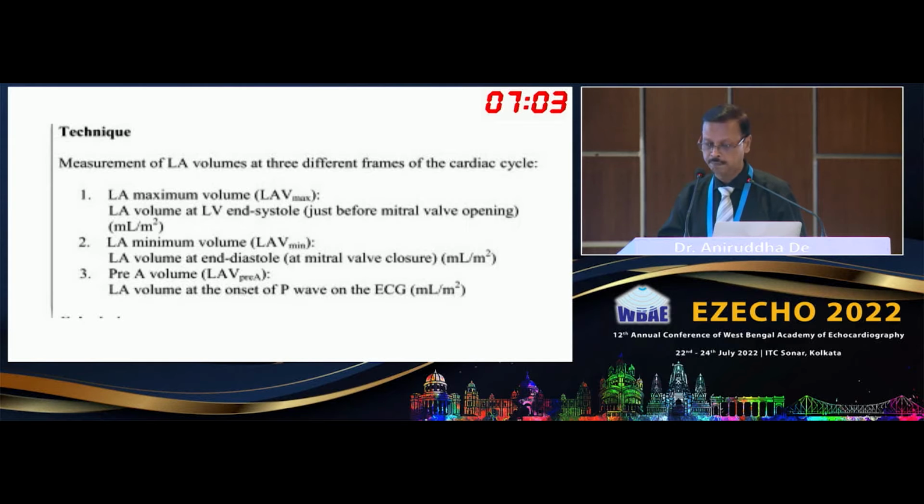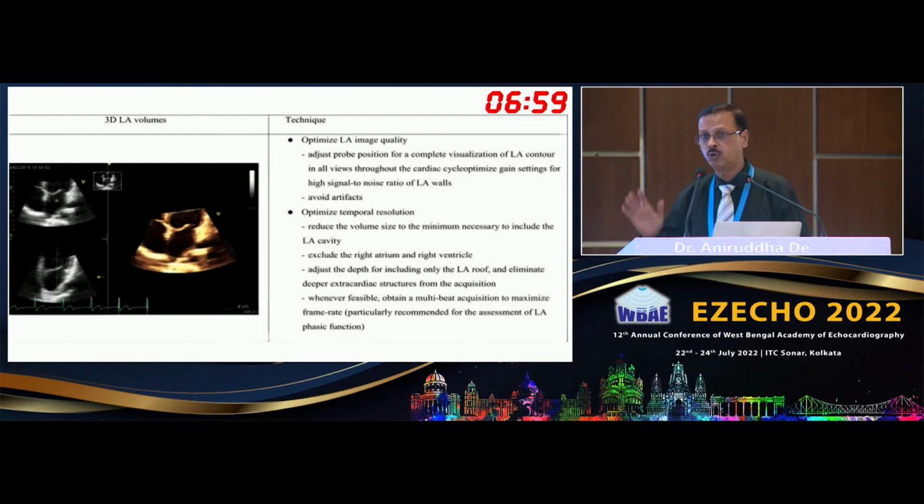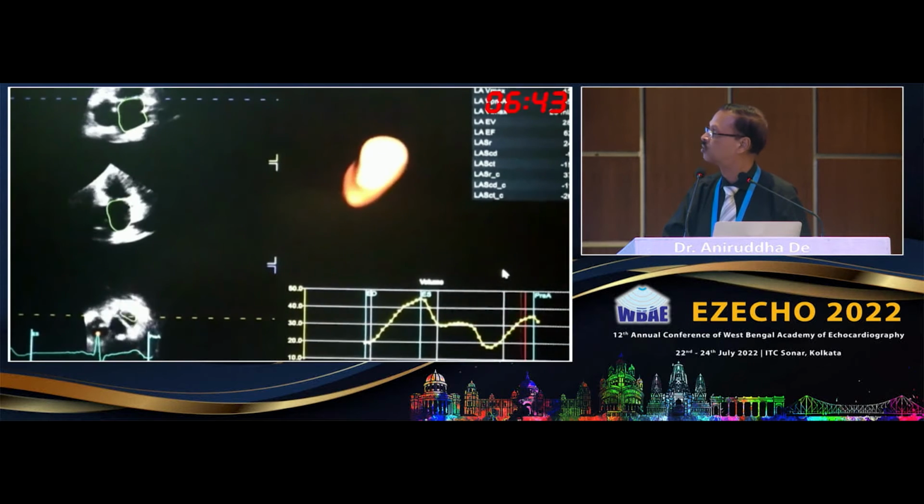Also, what is important is that you can do it either in 2D or in 3D. The same thing. Of course, 3D will give good parameters. These all I have discussed in the morning, that the LA axis and the LV axis are not the same. So you have to be very careful to find out the long axis of the LV.